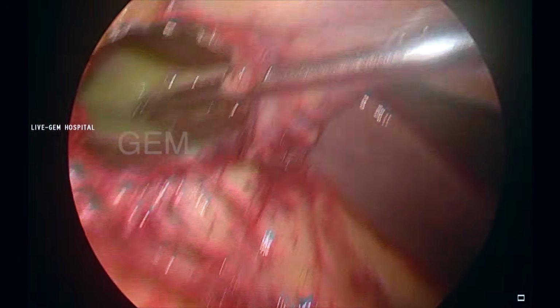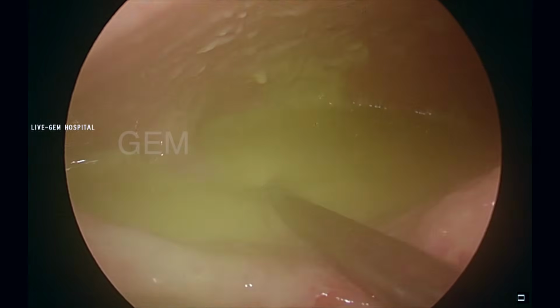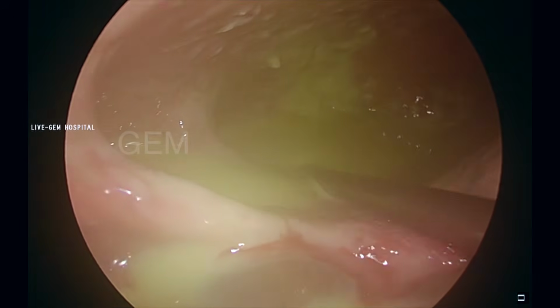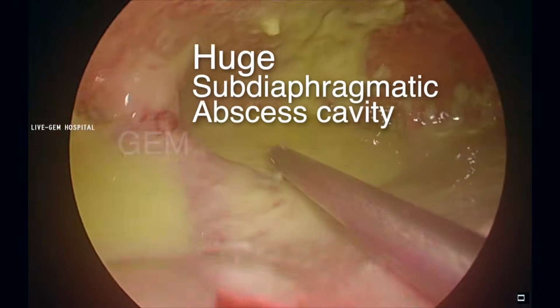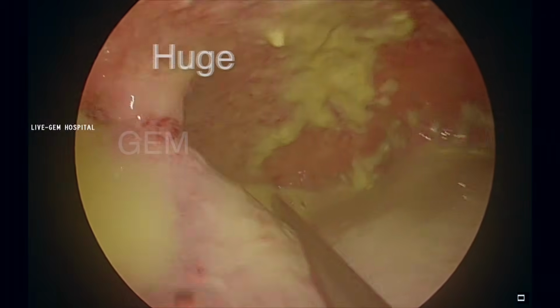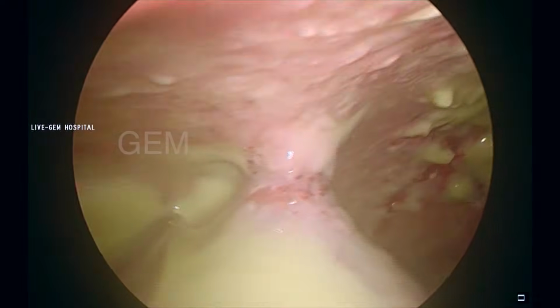Simultaneously with the pus, now you can see here it is enlarged, and that is the gallbladder, and you can see here it is a very huge abscess cavity between the diaphragm and the right lobe. You can see so much pus is there. A very virulent organism, long standing, not responding to medicine. So, entire gangrenous gallbladder with a lot of pus, a huge subdiaphragmatic abscess cavity. Just a simple gallbladder is making this type of problem.